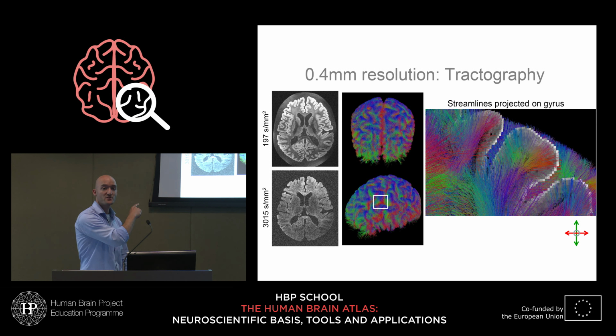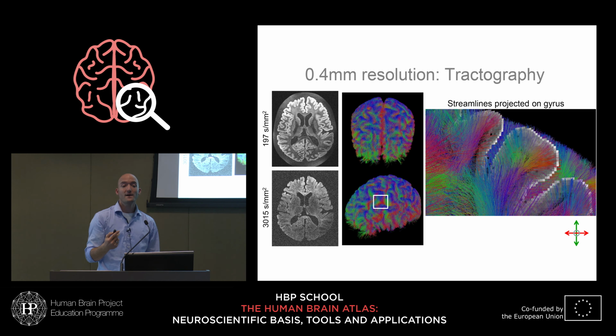So let's put this image on top of the 75 micron myeloarchitectonics, and now use our knowledge that these tracts are likely to end right in layer 3, which is just about at the height of the inner layer of Baillarger, right? Yes, you can do that, and yes, we should do that. I'm just saying that the diffusion alone doesn't have that information. We will need to put it in either from assumptions or from the other modality. We have that other modality I showed you.